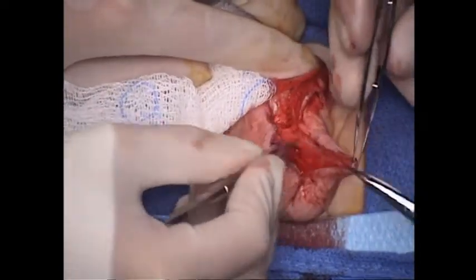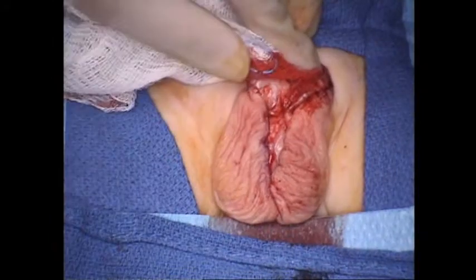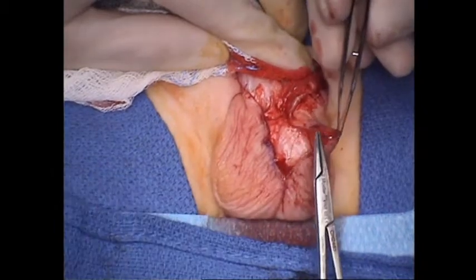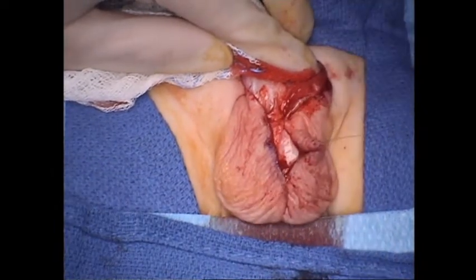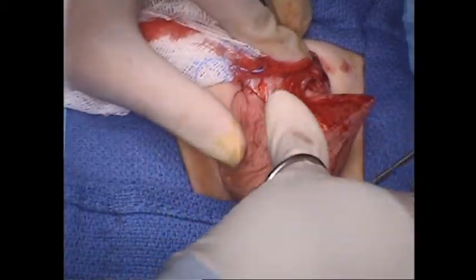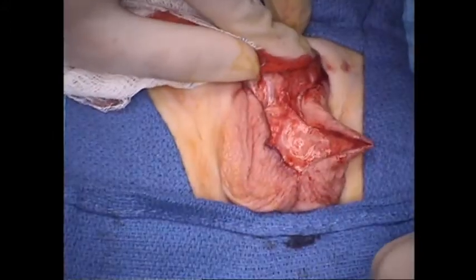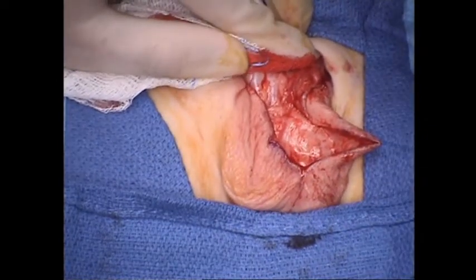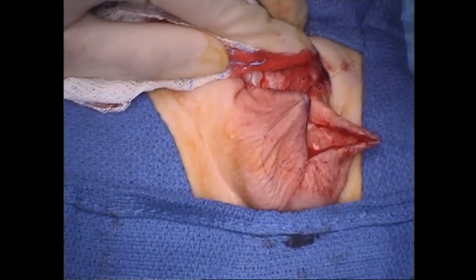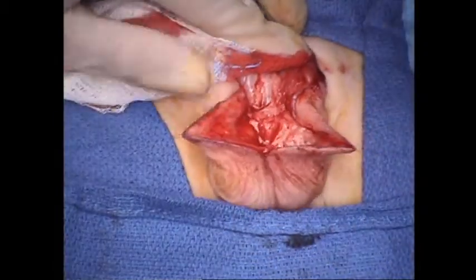But it's really important to get the best exposure that you can while hiding your incision lines in natural lines. And as you see, there's a natural line that's here. And so when you sew it back up, you don't see any visible scars except in a location that you would normally see it. And that's very important, to try to hide your incisions in places where it's not visible once things have healed up. So all of this surgery can be done through a circumferential circumcision and down the median raphe and into the midline of the scrotum.